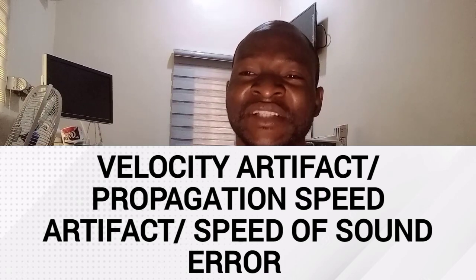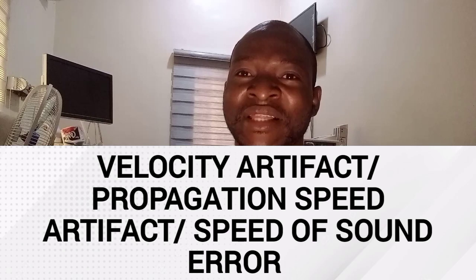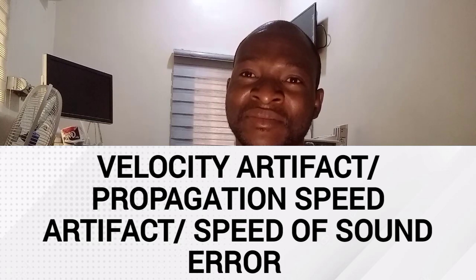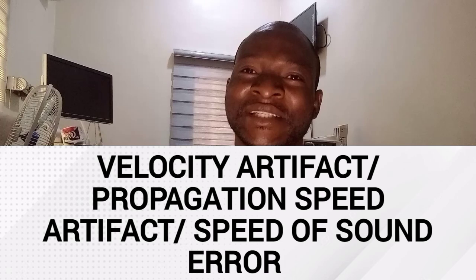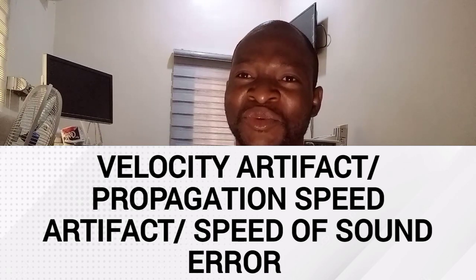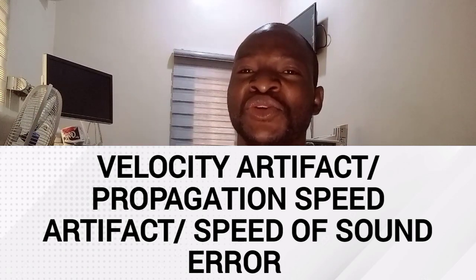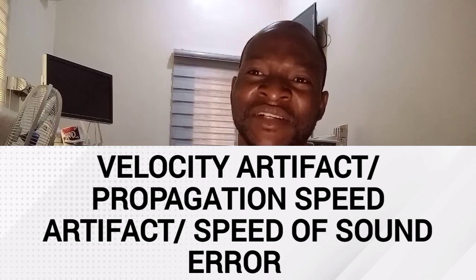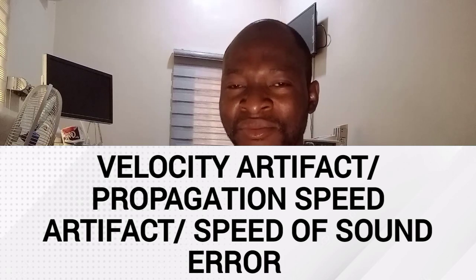Now, if the velocity in the tissue is slower than in soft tissue, remember the velocity of sound in soft tissue is 1.54 millimeters per microsecond. If it's less than that, then all the go-return times will be longer than they should be, and the result will be that the echoes will display farther from the transducer than they should be.